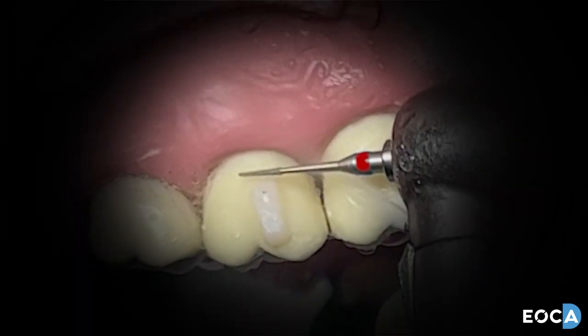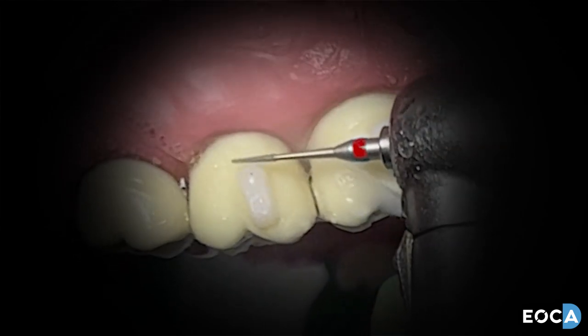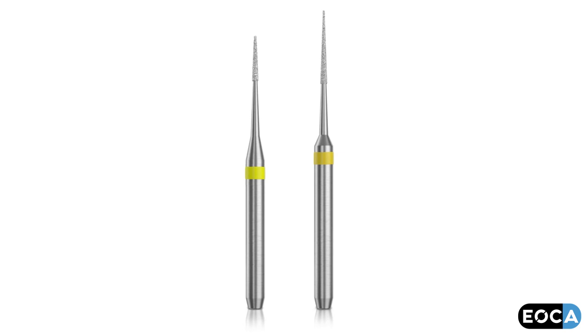Once the excess has been removed, change to the red burr and polish the attachment-enamel interface. Then swap to the superfine yellow band burr and polish the enamel to a high luster.